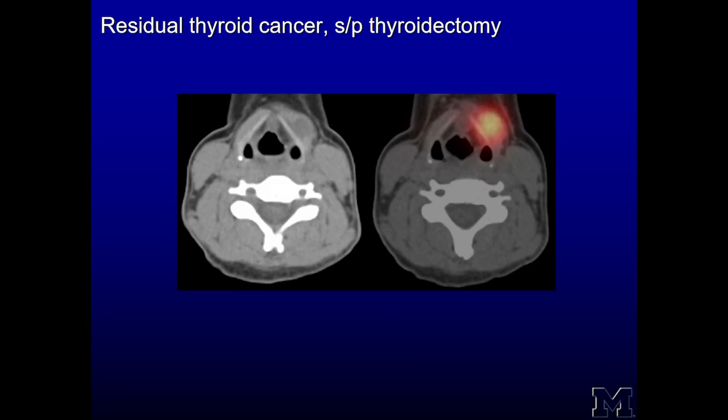However, SPECT-CT can help us clearly differentiate remnant ablation from residual thyroid cancer. For example, in this case, the CT correlate clearly shows hypodense lesion with clear activity on the SPECT-CT, very abnormal as compared to contralateral side. This is entirely consistent with residual tumor in the left neck, which will be amenable to treatment.